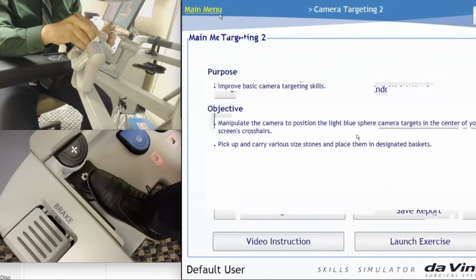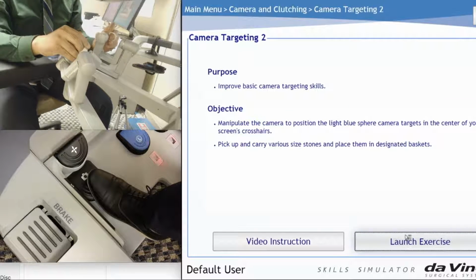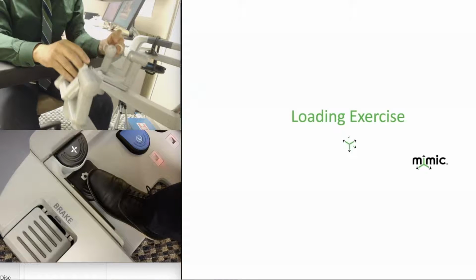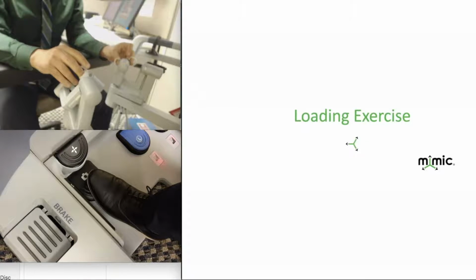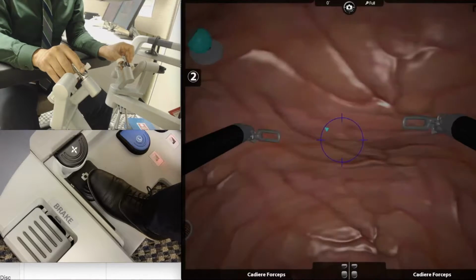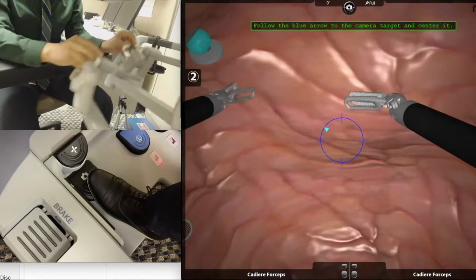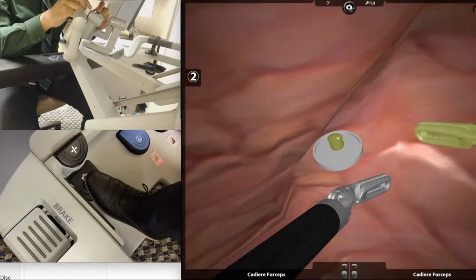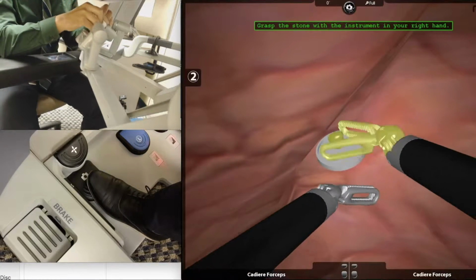Now we'll go over a couple of things that you might encounter during your training. As I explained before, clutching is a major part of this task. Failure to clutch increases your chances of instrument collision, and as demonstrated here, lack of support of your forearm makes fine movement more difficult.